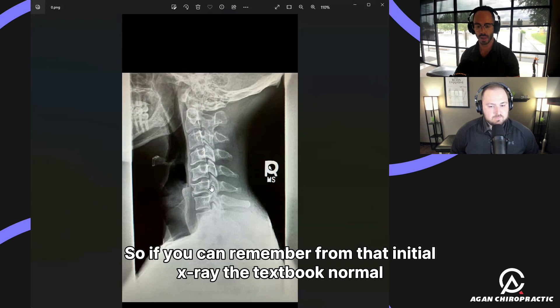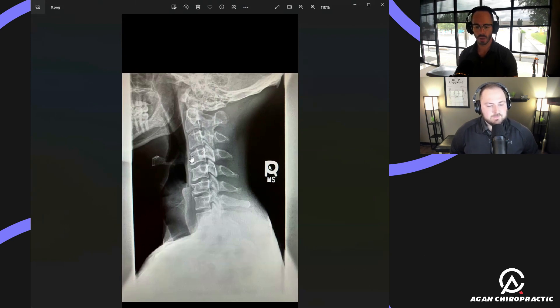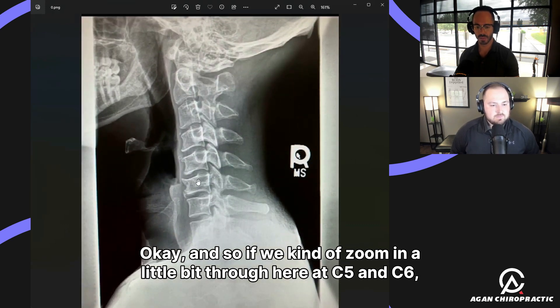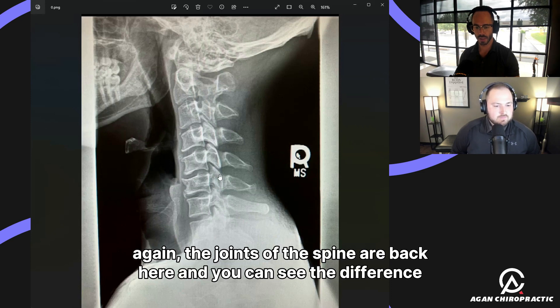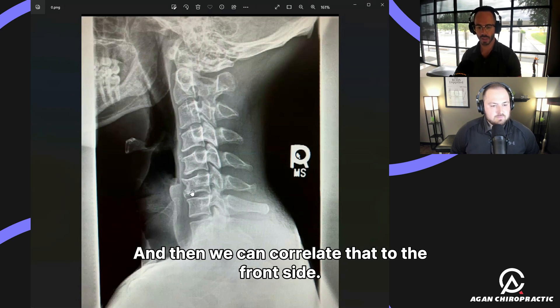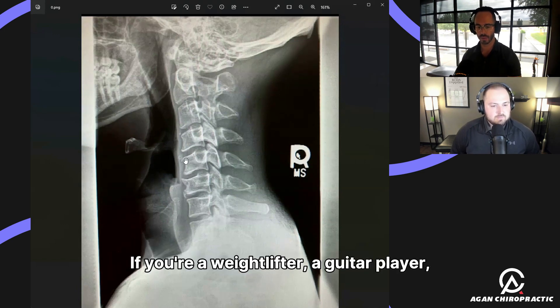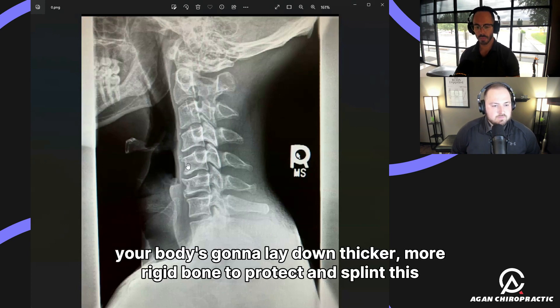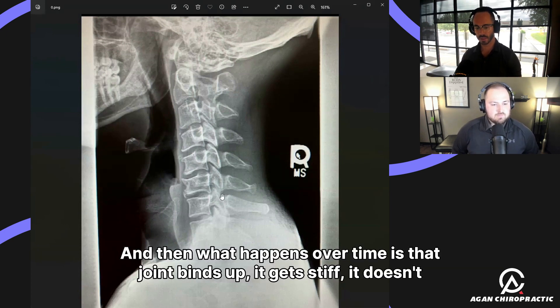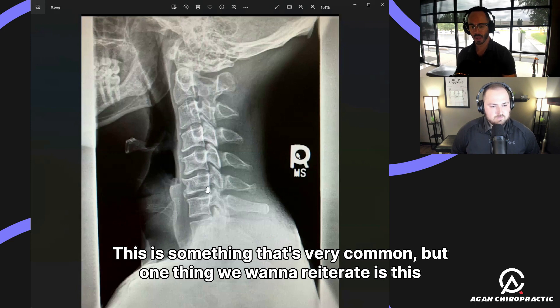This patient is a 34-year-old male, grew up playing sports, very active, weightlifting, collegiate athlete. He came in with chronic neck pain, pain going down into the left shoulder blade, and overall stiffness in the morning that gets better throughout the day with movement. If you remember from the initial X-ray, the textbook normal had a C curve. Zooming in on C5/C6, you can see the difference in joint space and a deformity in the bone — a sign of stress. Like a callus on your hand, the body lays down thicker, more rigid bone to protect and splint the area. Over time that joint binds up, gets stiff, and we see this straight up-and-down curve.